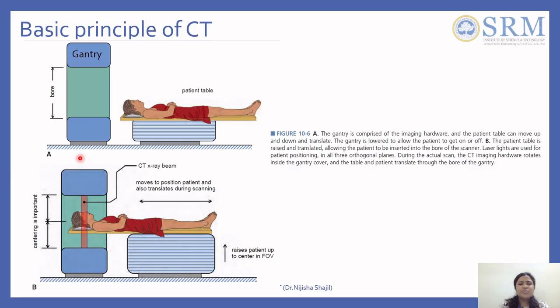Okay. So this is how a CT machine is set up. You have something called a gantry, which is nothing but your donut shape. In the gantry you have a hole, because at the top you have the X-ray tube, and you have a detector. Top and bottom means it keeps rotating. At one place you have the X-ray tube, and at the other place you have the detector. The X-ray tube is going to give the X-rays. These X-rays come through a very fine pinpoint hole, because it's a very small area, so that it falls precisely into the patient, and I'm going to use the detector for detecting it.